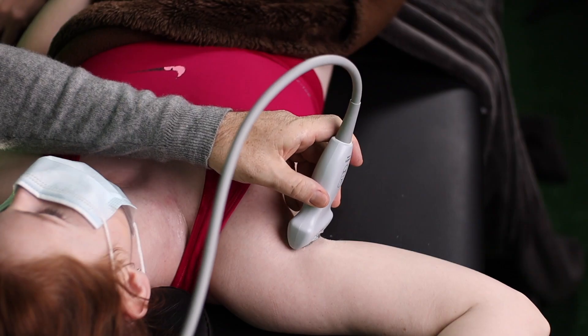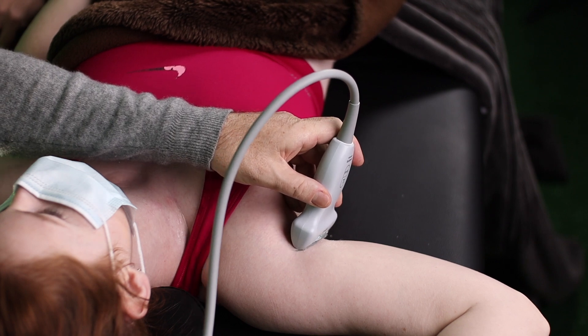Hey, I'm sure and I'm Jeff, welcome to Walk Around the Block video series. We're going to talk about the axillary block — a classic. It's great for those patients where there are coagulation issues; it's superficial and compressible. With ultrasound I think I'm doing the same as when I got shown how to do it with arterial cannulation. This block has fallen a little out of favor with the rise of supraclavicular and infraclavicular, but it's good to have in your back pocket when you need it.